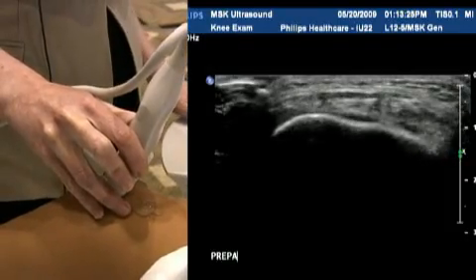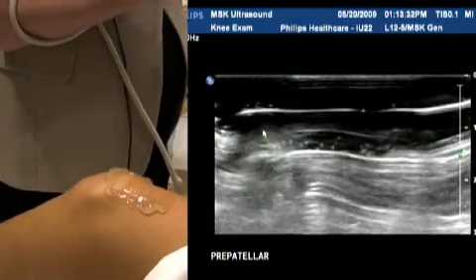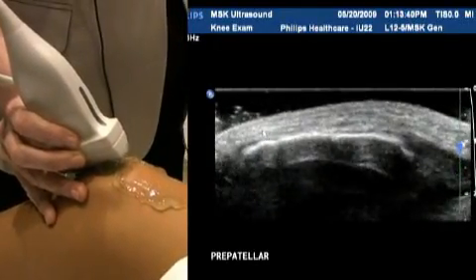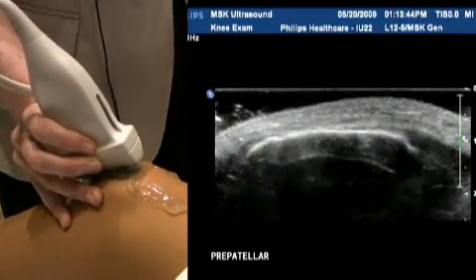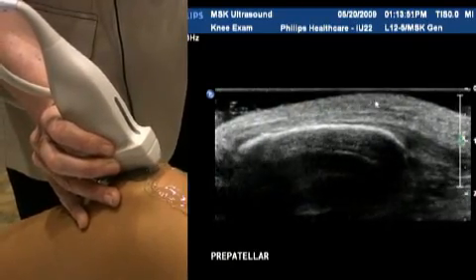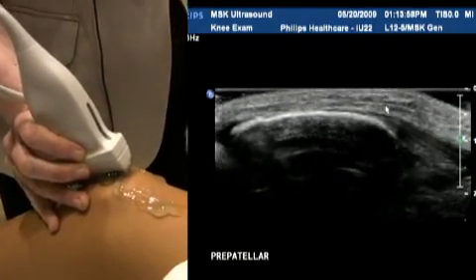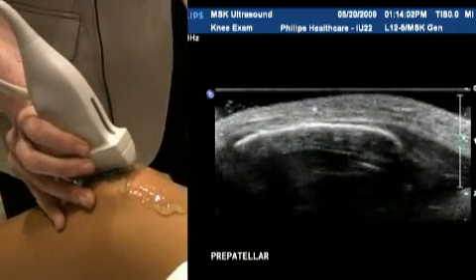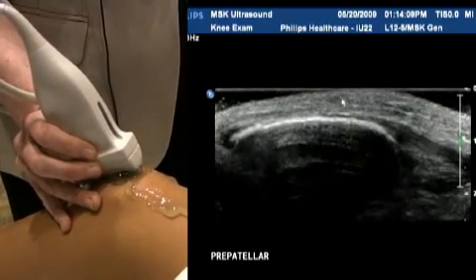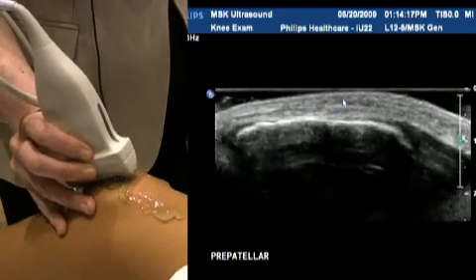We're going now to the pre-patellar area of the knee. There is a bursa that lives in this spot, and patients will invariably present with inflammation or a bump on top of their knee. You need to use a fair amount of gel for the pre-patellar portion — I've created a little standoff with thick gel because the pre-patellar bursa sits in the subcutaneous region above the patella tendon. If you push too hard you can completely compress it, so make sure you're not pressing too hard and obliterating the bursa completely.